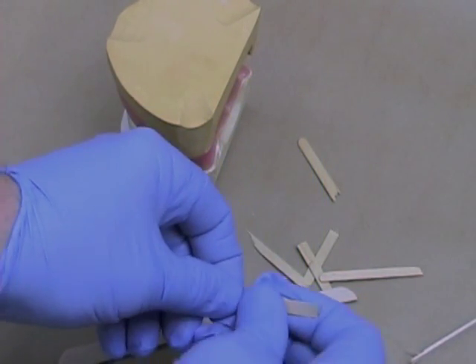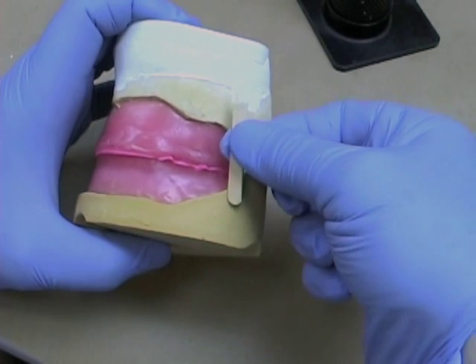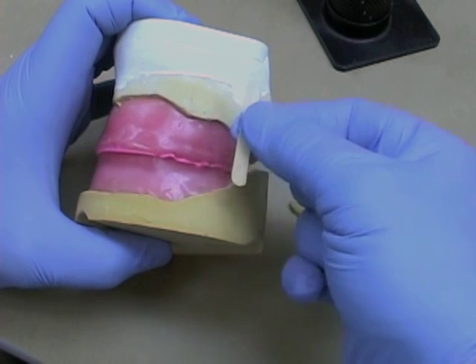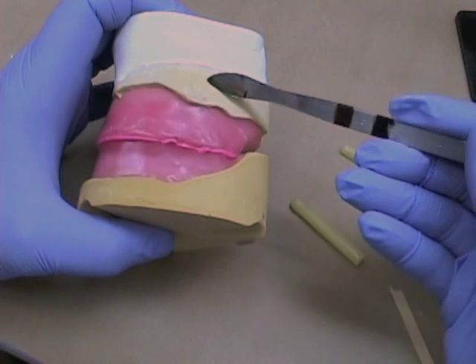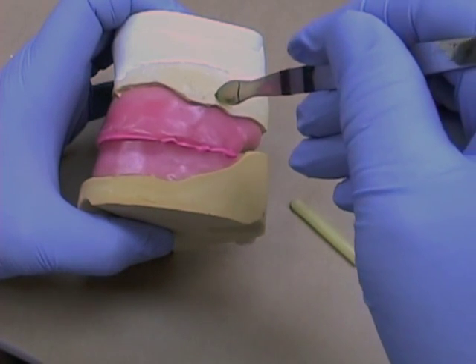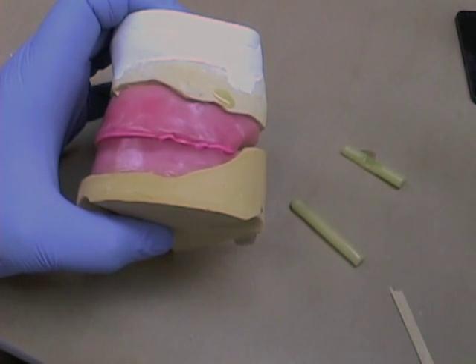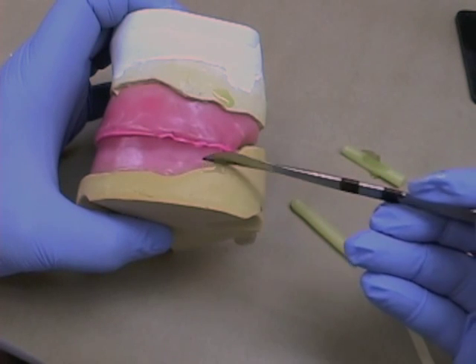Never try to stabilize a cast by using your hands alone. Use at least three of those broken coffee stir sticks to stabilize the maxillary and mandibular cast together. Measure between the two to see if you've got one of the proper size. Then melt some sticky wax — make sure it's very, very hot, molten — and add that to the places on the cast where you'll be attaching your stick.